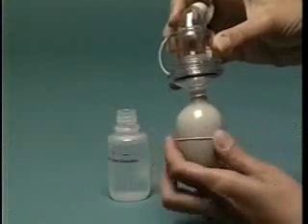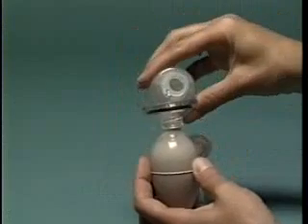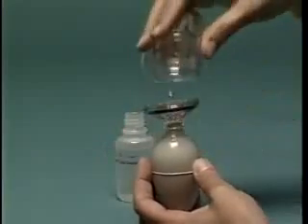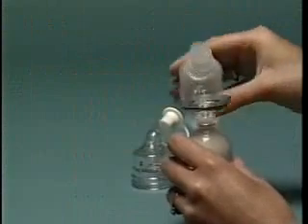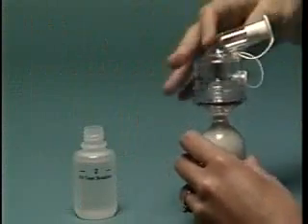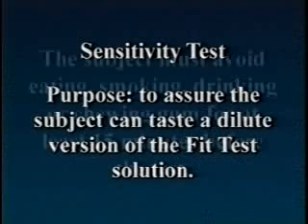Next, pour approximately 1 teaspoonful of the sensitivity test solution in bottle number 1 into nebulizer number 1. Pour the same amount of fit test solution from bottle number 2 into nebulizer number 2. A sensitivity test is conducted before the fit test to determine that the healthcare worker being tested can detect the test aerosol at very low levels.